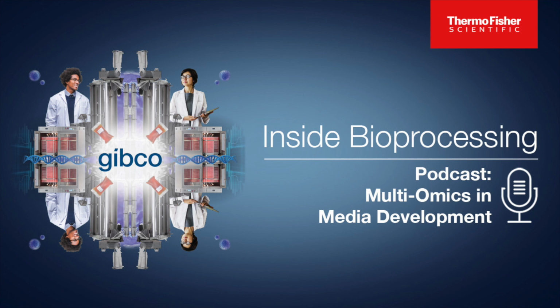And how it exactly works is you're going to take samples over a period of a cell culture process. Generally, most sample plans will start with a day 0 sample, and then something like day 3, 5, 7, day 12, day 14, something along those lines, so you can see across time what is happening to all the metabolites within the formulation. So you'll take your sample, you'll spin out your cells, try to clean it up a little bit so that you can actually run it across the LC, or liquid chromatography, in order to be able to see what is actually in the formulations.